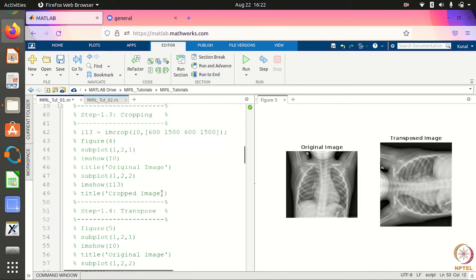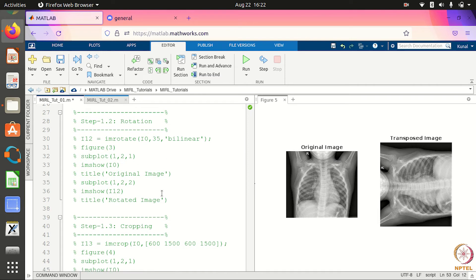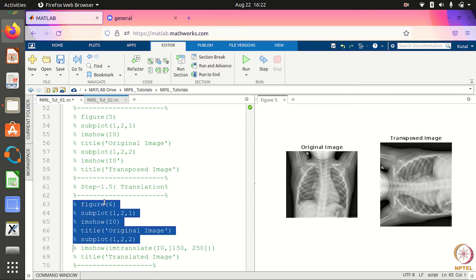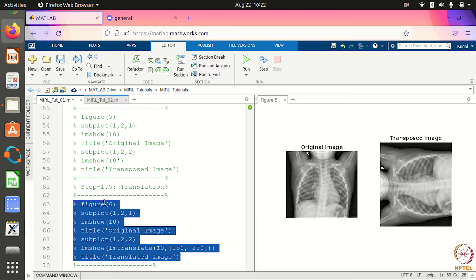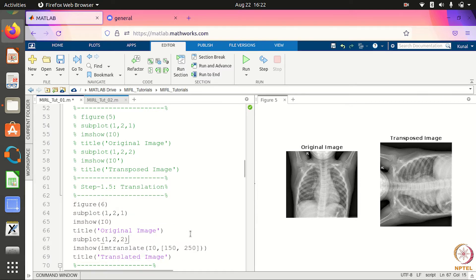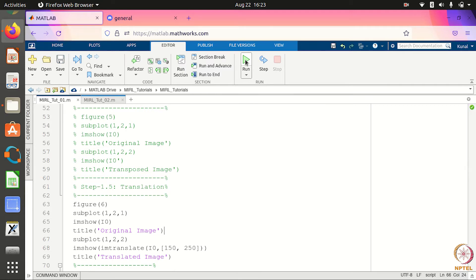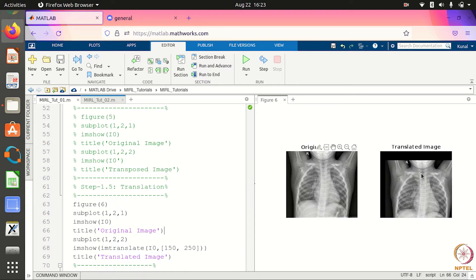Now we show some rigid transformations. Rigid transformation means the shape of the image will not be distorted. The first rigid transformation is translation — suppose I have a chest X-ray image and I want to translate it. The translation in the x-direction is 150 and in the y-direction is 250. The command is imtranslate. When you run this command, your image gets translated by the amount specified — 150 in the x-direction and 250 in the y-direction.